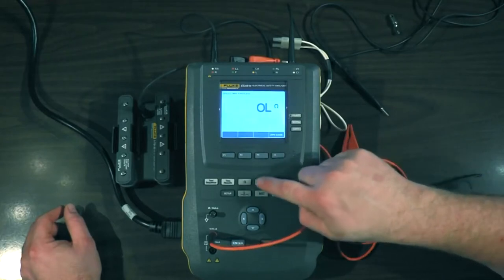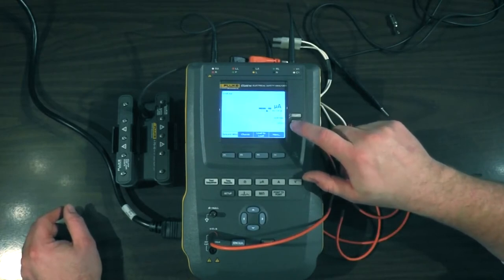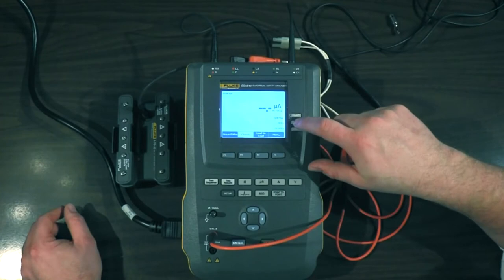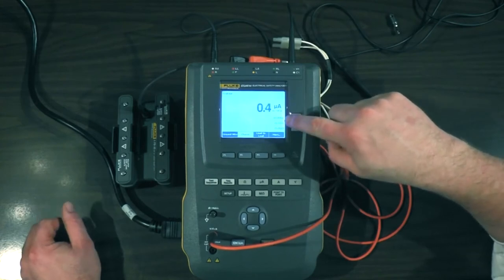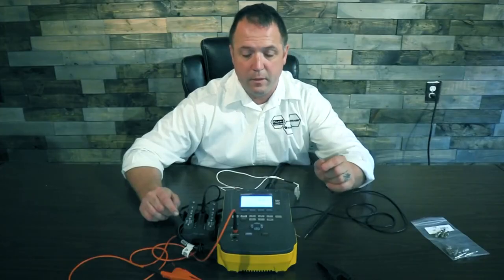Now do your ground wire resistance, then back to leakage. We can do our ground leakage — forward polarity, open neutral for single fault condition. Chassis leakage — normal polarity, open earth for single fault. If you need reverse polarity testing, simply push the polarity button once to off and a second time to reverse, then back to normal polarity for forward polarity, normal conditions.